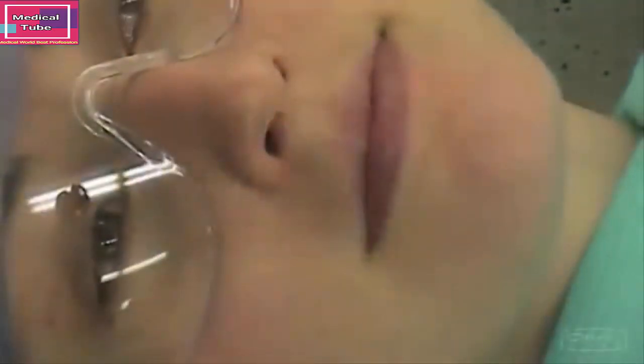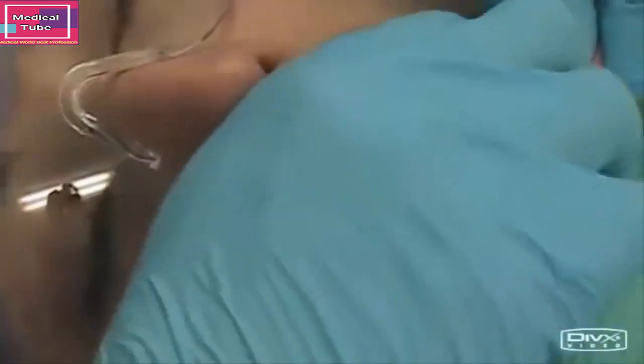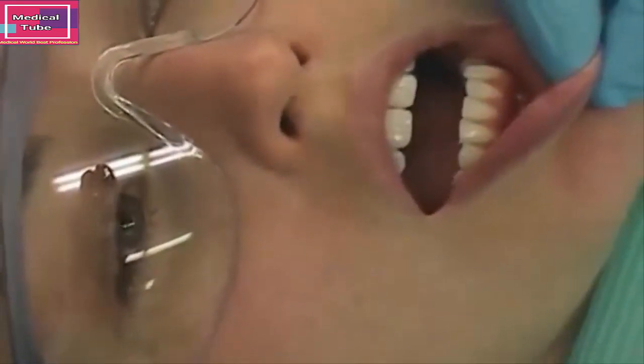We're going to do an infiltration on the 23-24 area. The nerves are the long terminal branches. The areas to anesthetize for the maxillary is the pulp, soft tissue, bone in the area of the injection. For the mandibular, it's only the soft tissue in the area of the tooth.